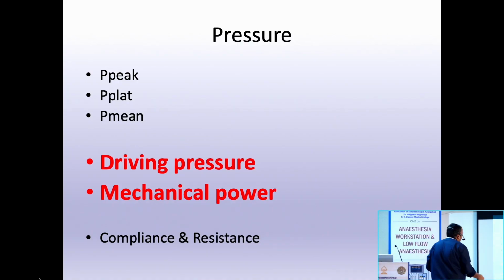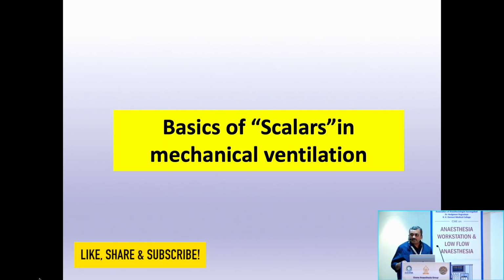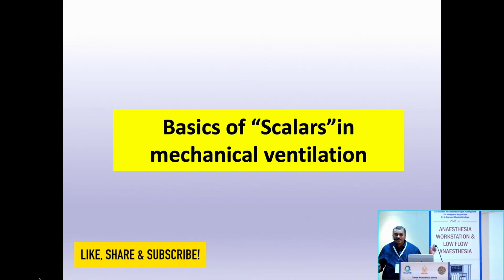And now more and more people are slowly talking about mechanical power. Mechanical power is still difficult to get into your routine anesthesia machine, but driving pressure is something which is going to be there, and we need to be very clear about it. Okay? Scalars. So we'll talk only about the scalar. That is the last part of the presentation.